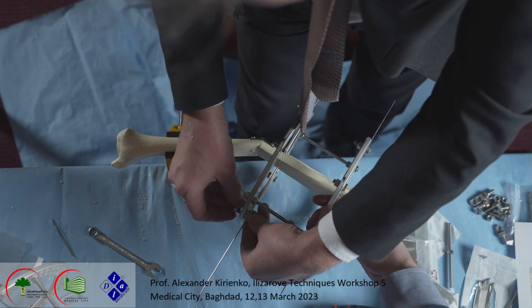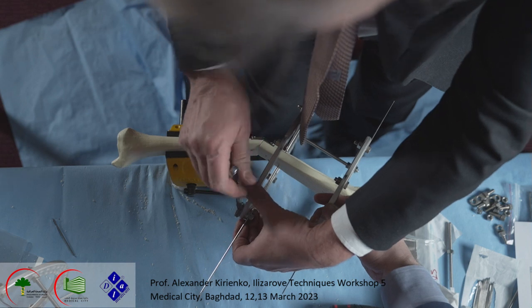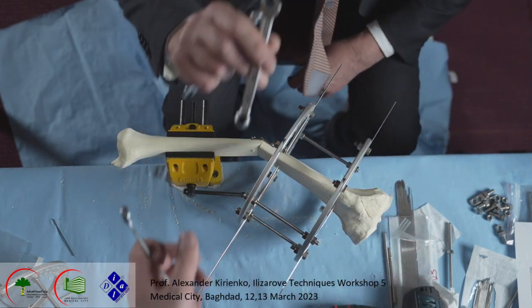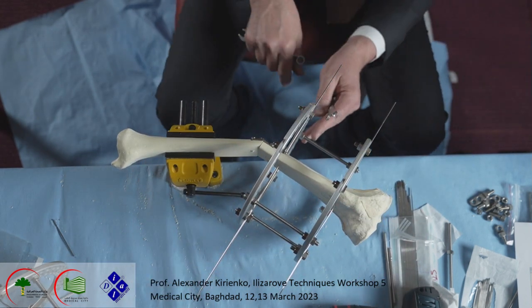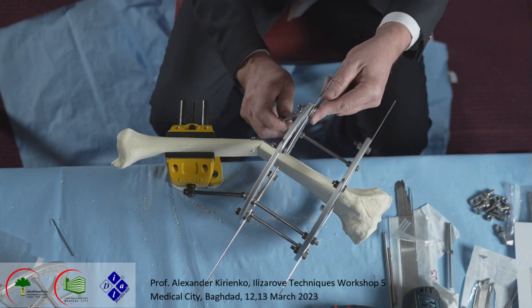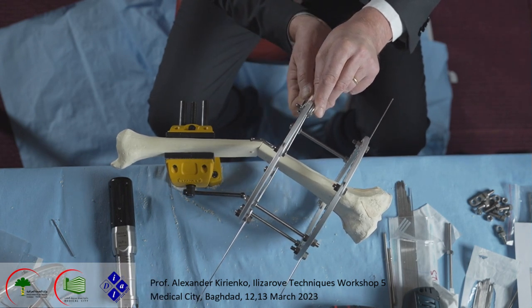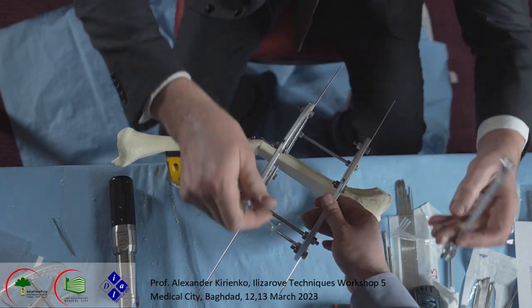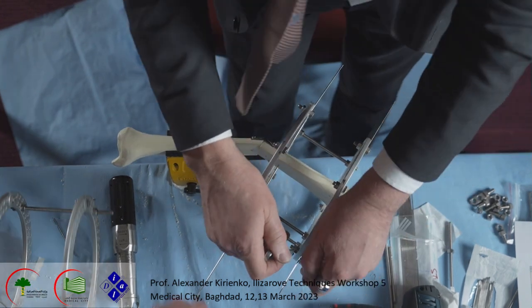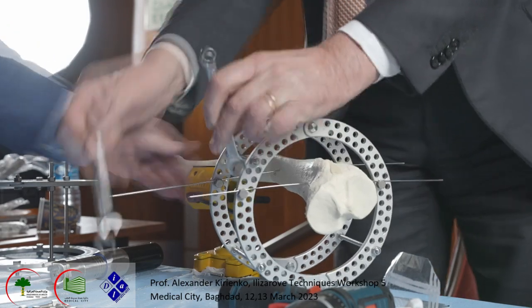It should be attached with a washer, a spacer. Perfect. If we don't want to lose the stability and the realignment, for this reason I use the tensioner like this.